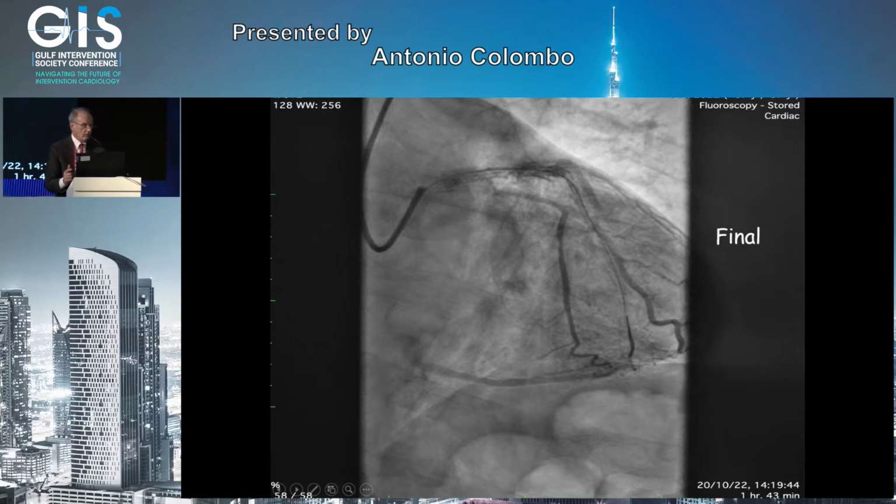So 4 millimeters of mercury of gradient was already present in the stent. So the gradient created by the dissection was only 4. I see. So you went with a 2.5 balloon, or you downsized the drug? We went with the 2.5 and we did a trio of drug-coated balloons in the mid and the 2.5 more distal.